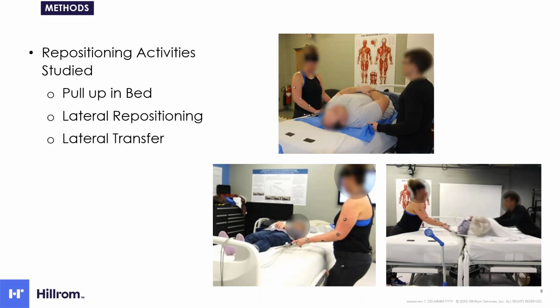For lateral repositioning, it is a task that laterally moves the patient from the center to the edge of the bed. It is usually performed before turning the patient so that the patient has room to be turned. This is a 1-person task.